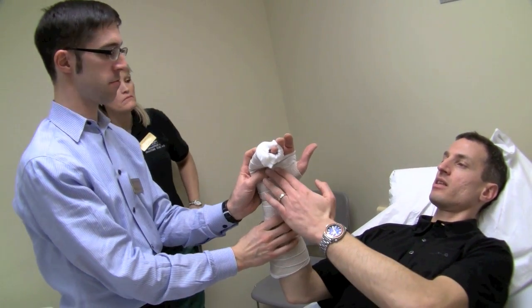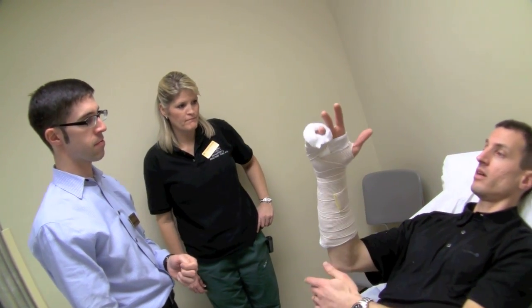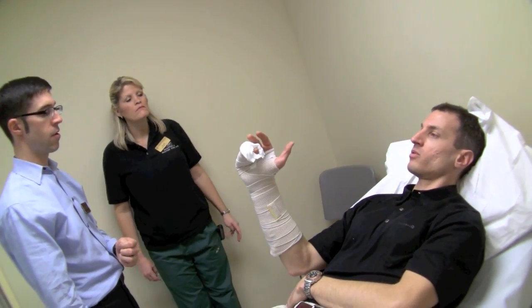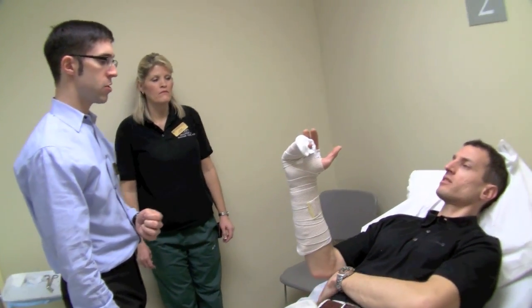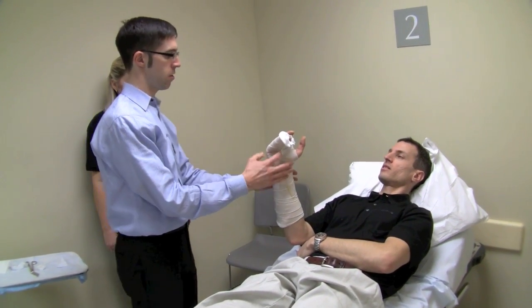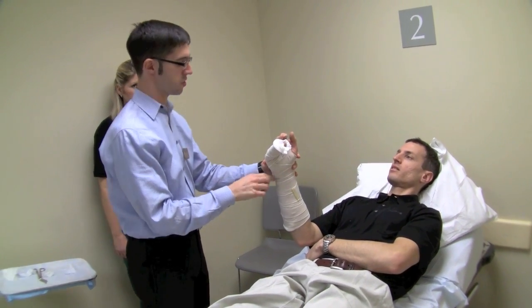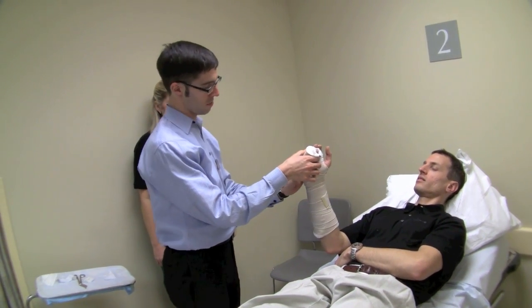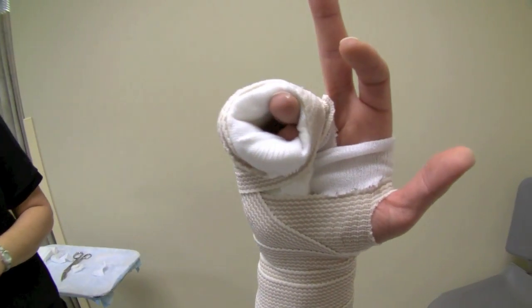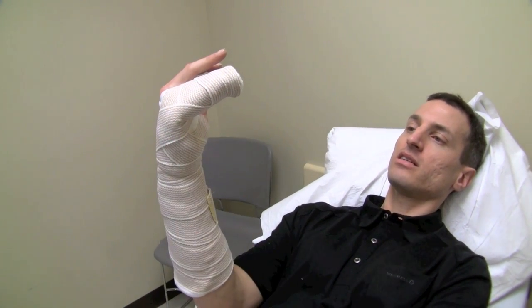Besides the fingers coming in like this — which is the problem — you want them like this, and that's the ideal position. Do you see any other problems with this ulnar gutter splint? If you're really holding it hard as you mold it, you can create wrinkles that put pressure over the ulnar head. Or if you bring them into ulnar deviation, you'll create a big wrinkle that causes skin irritation. The key thing is that MCP joint and getting a smooth transition — checking for little extension at the wrist and 90 degrees at that MCP joint.